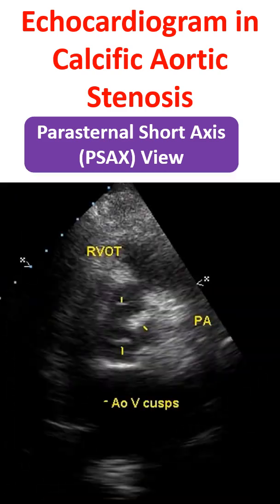Still image in parasternal short axis view in calcific aortic stenosis showing three leaflets in open position, i.e. systolic frame. The markers show the leaflets. The commissure between the left and right coronary cusps appears fused and thickened.